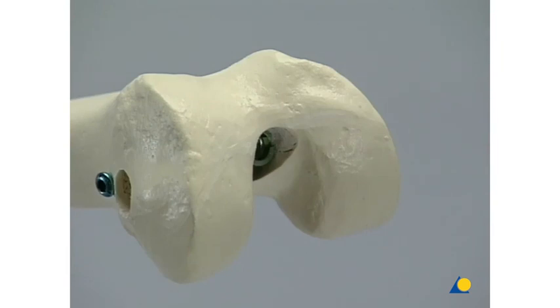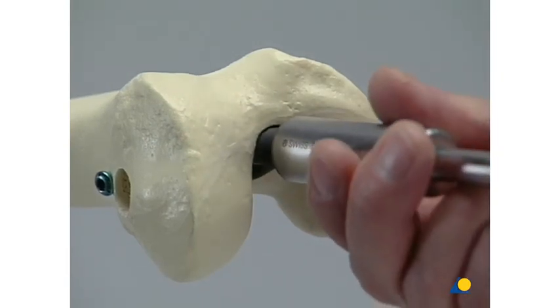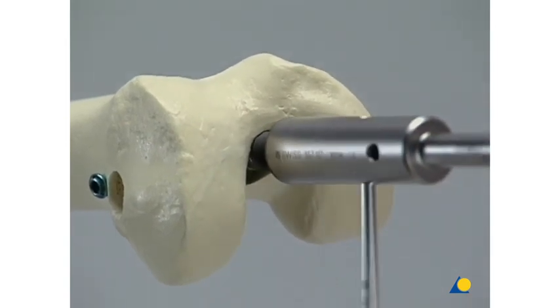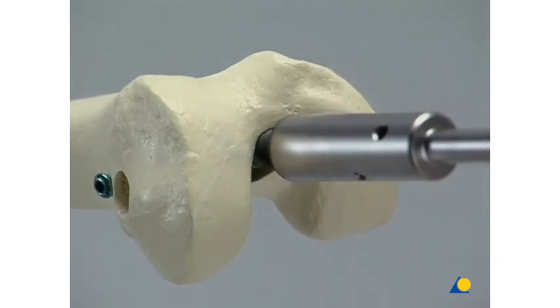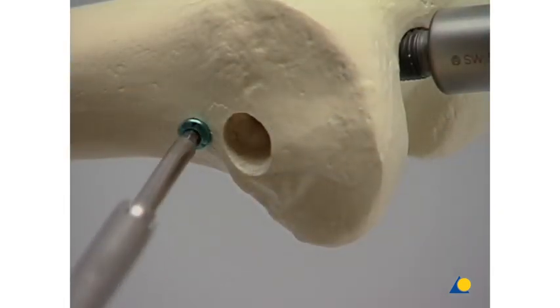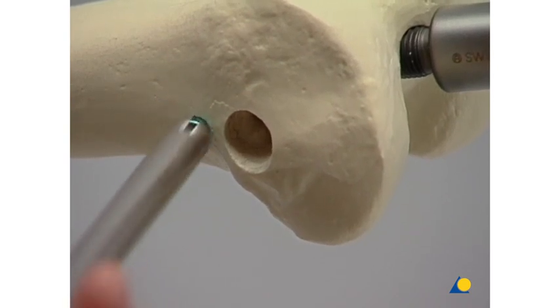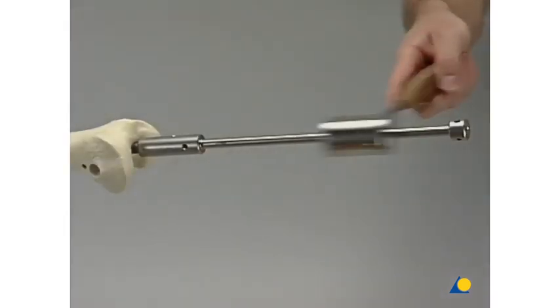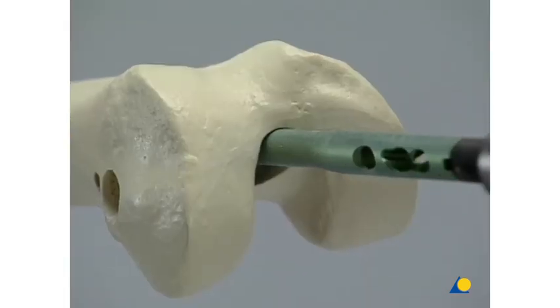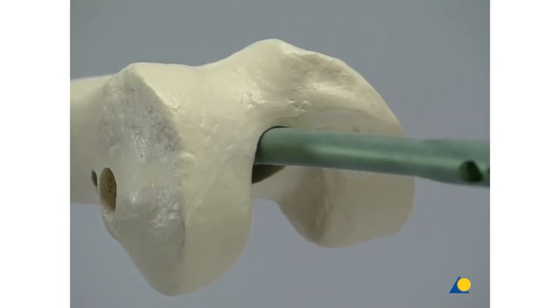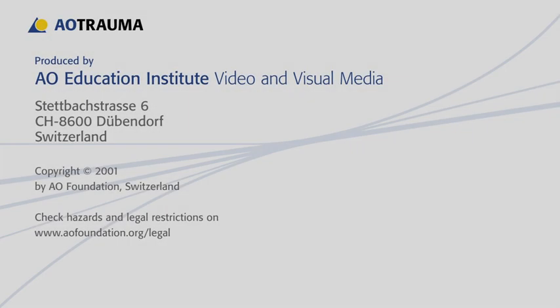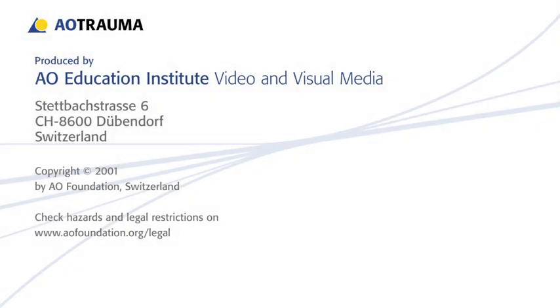One locking implant has been left in the site to prevent the nail from rotating or sliding away proximally while the hammer guide is being attached. After the hammer guide has been attached firmly, the last distal locking implant is removed, along with any proximal locking implants. The nail is extracted with the slotted hammer.